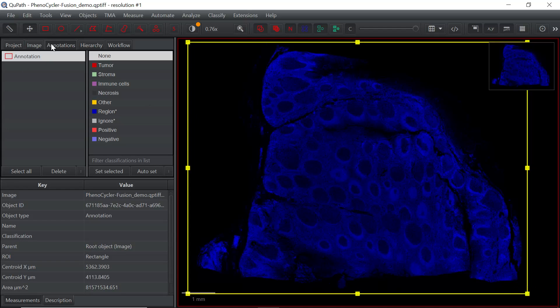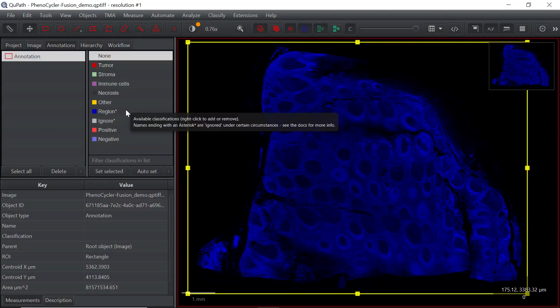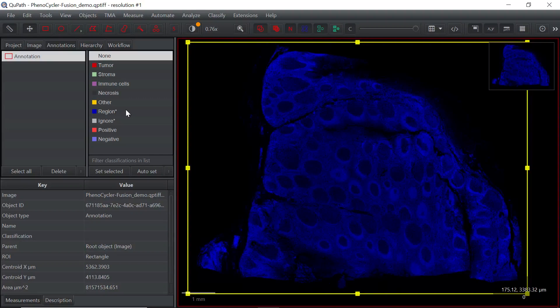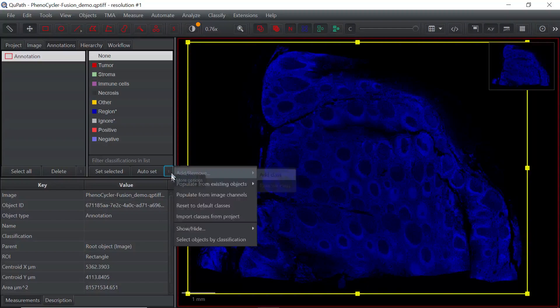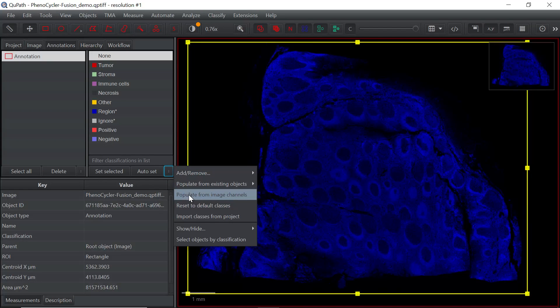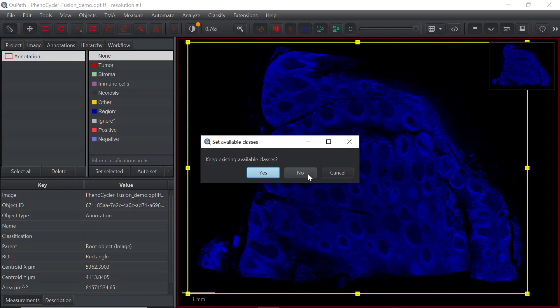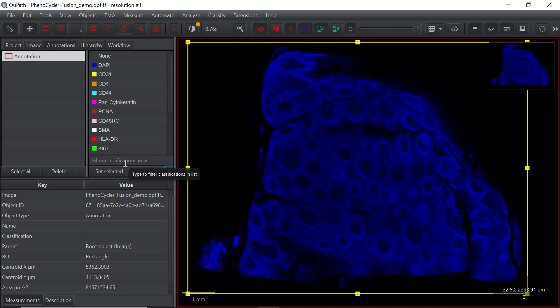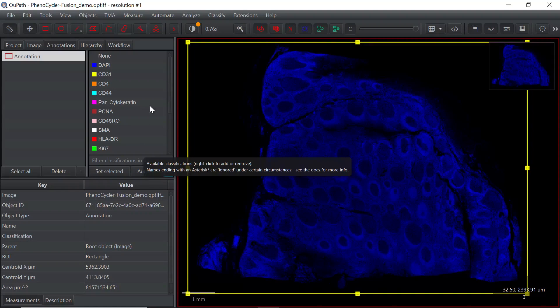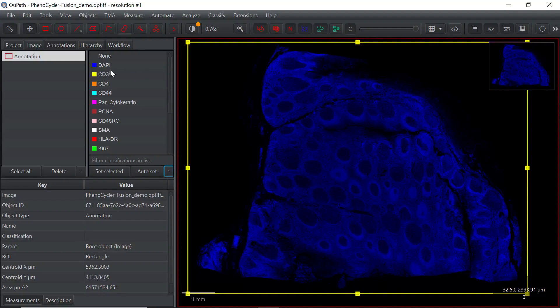We can use the rectangle tool to select the whole image for today's demonstration. Now you can see in the annotation window we have selected the whole image. In this window, you can see the default settings for filter classifications. Because we want to get the staining information for each antibody — we have 16 channels — we want to set the channels as the filter classification list. Click the button and use 'Populate from image channels'.